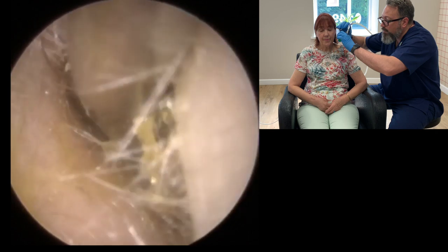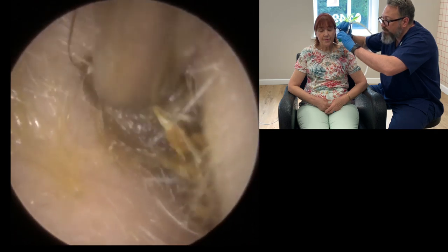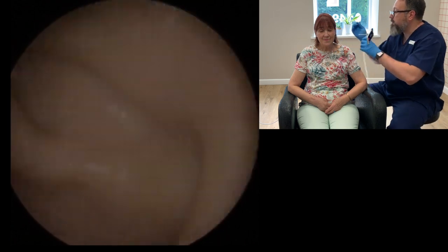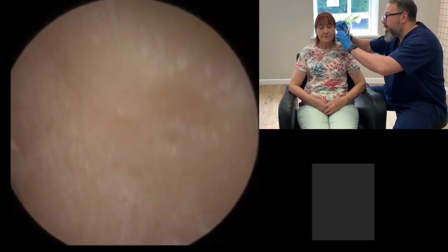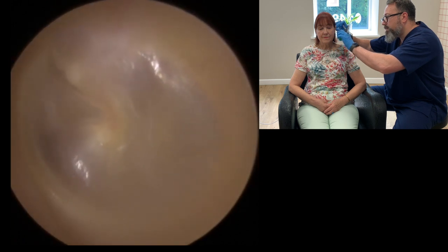We're just maneuvering it — we've got hold of a harder piece there. You can just see it starting to come away, just really wiggling. We didn't have to work very deep in the canal for this one; the wax had migrated most of the way out but just stuck at the entrance. So we're just getting rid of that little piece off the end, just going back in to take a look. And what we can see here is a really lovely, healthy-looking eardrum — absolutely perfect.